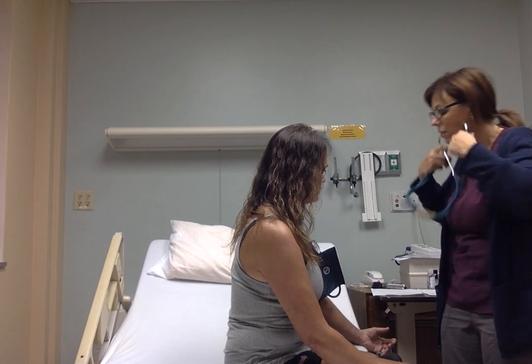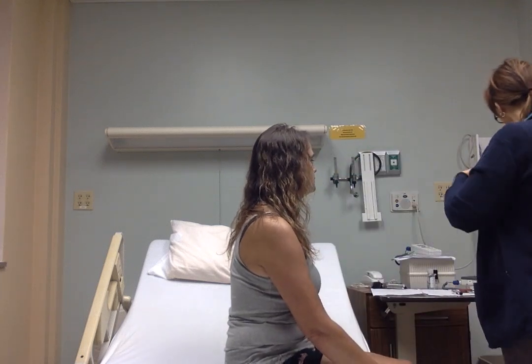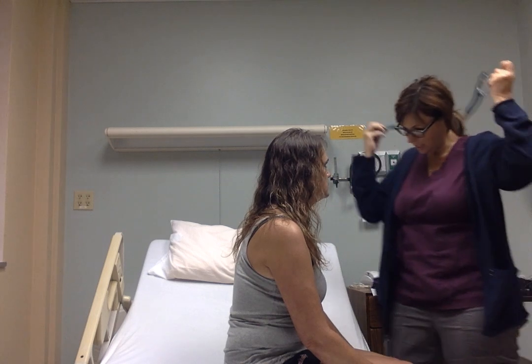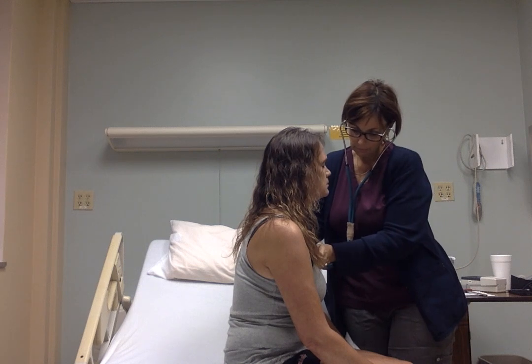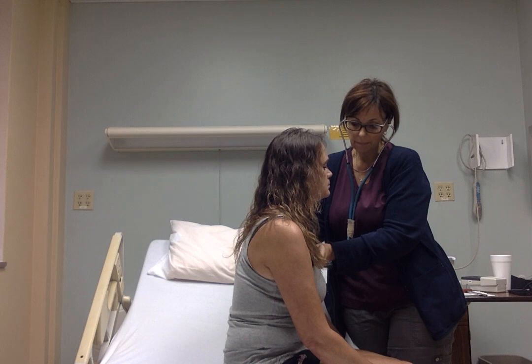Right. 118/76. That's excellent. I'm going to be listening to your heart rate, and as I'm doing that, I'm going to be listening and checking your respirations. We would be doing this for a full minute, but unfortunately they've taken my clock out of this room, so we'll simulate that.